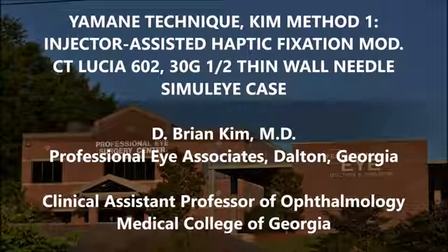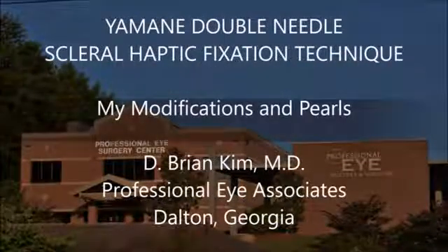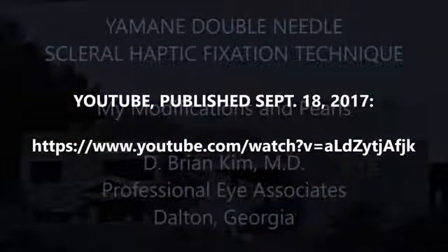I first described this technique that I developed on my YouTube channel and published it on September 18, 2017. It's titled, My Pearls and Modifications of the Yamane Scleral Haptic Fixation Technique, a Stepwise Approach.